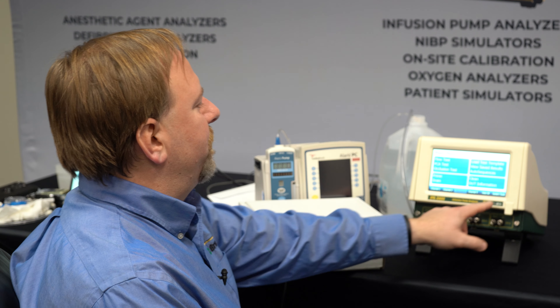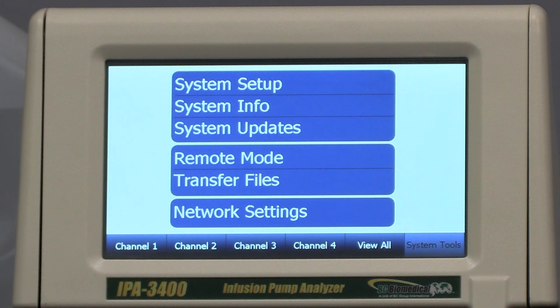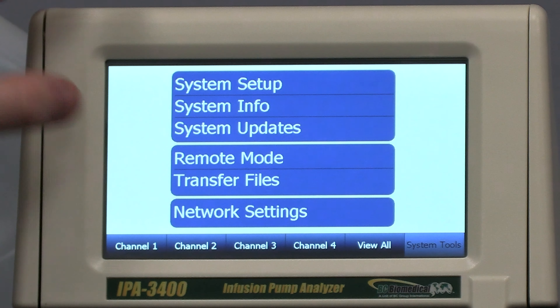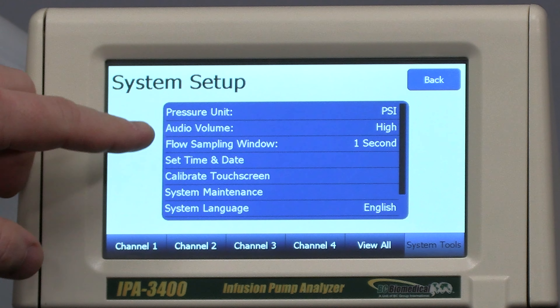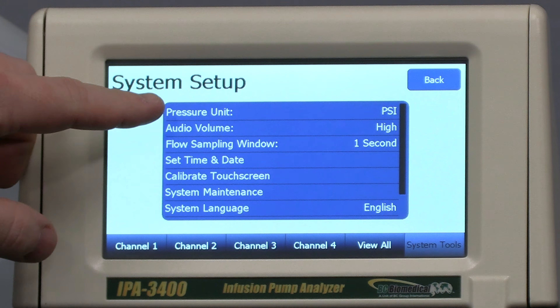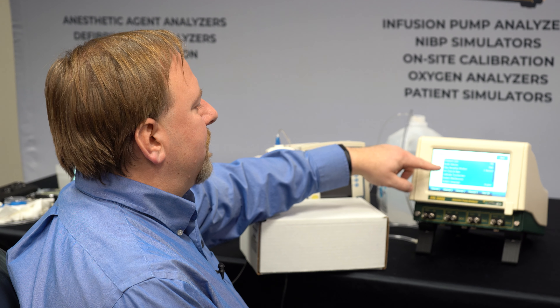In this segment we're going to demonstrate the administrative functions of the IPA 3400, the system tools screen, and also how to remove the flow modules and reinstall them for calibration. The system tools screen can show us a lot of information and configuration about the IPA 3400.